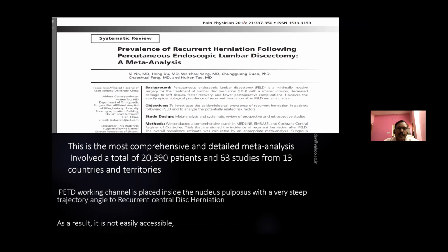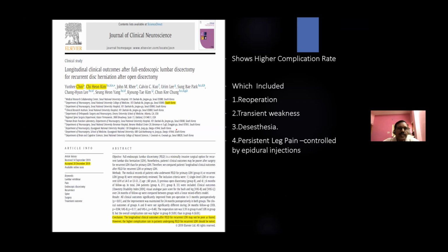Now come to full endoscopic lumbar discectomy for recurrent disc herniation after open discectomy. This article was published in South Korea in 2019. It shows a higher risk of complications, which includes persistent leg pain controlled by epidural injections.